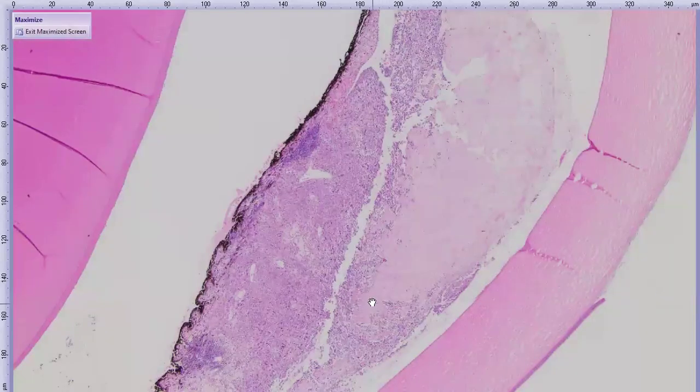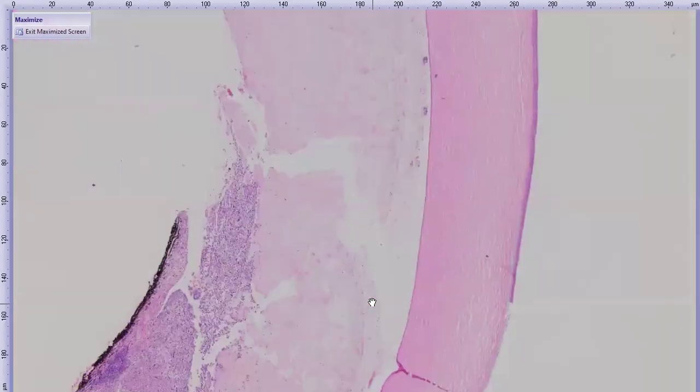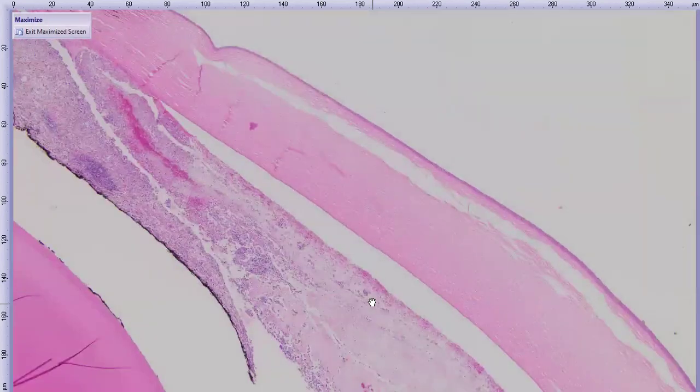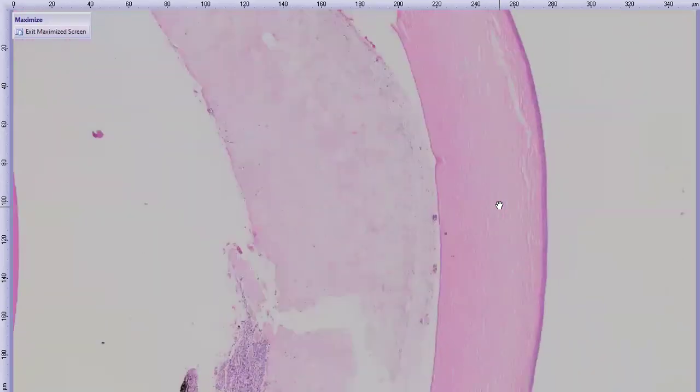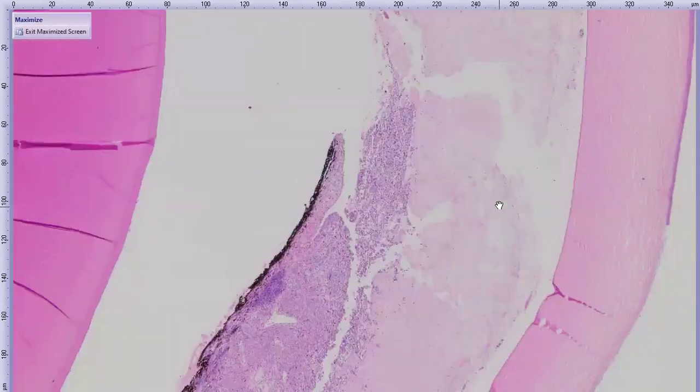Just about the cornea, I want to point out how unremarkable it looks histologically compared to that clinical image. That highlights how sometimes we underestimate or are not able to diagnose corneal edema changes, like a little bit of pallor. Looking at the clinical photo, obviously there was edema, but agreed, it can be more subtle histologically compared to what they're seeing clinically. Sorry to interrupt. Oh, no worries, it's a good point.